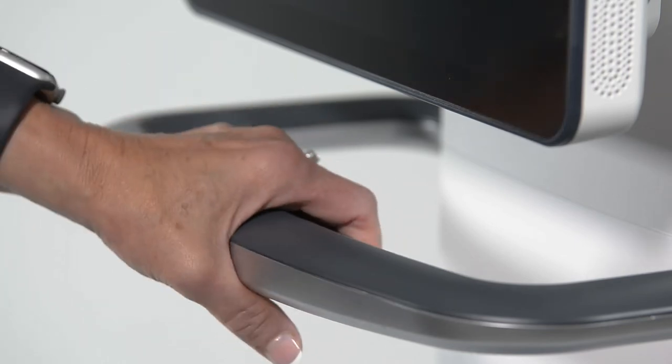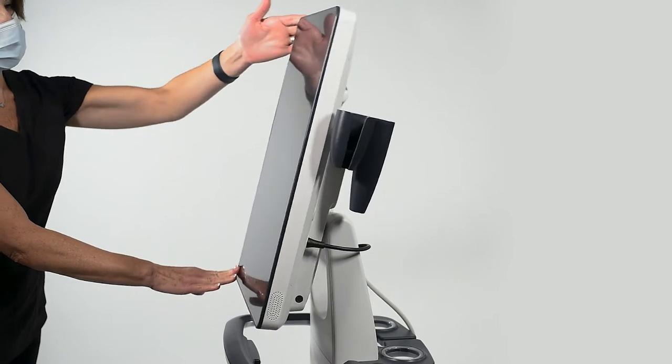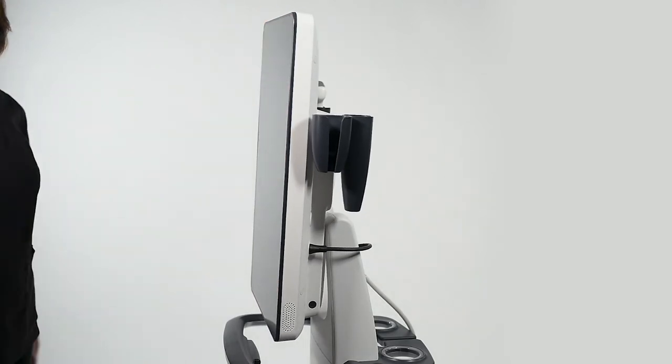To adjust the height of the system, depress the handle on the cart and raise or lower. To tilt the screen, push in at the top or bottom of the monitor to angle high or low.